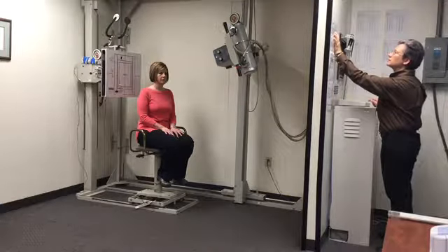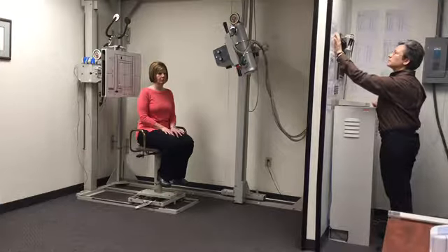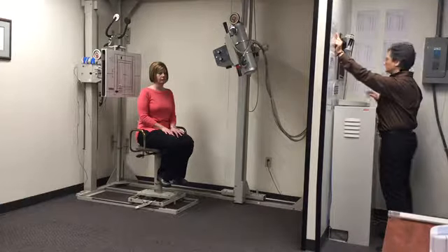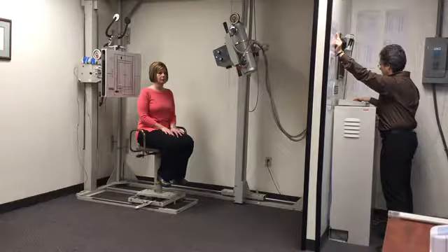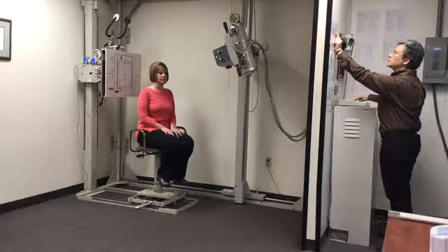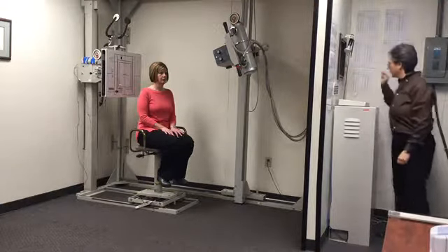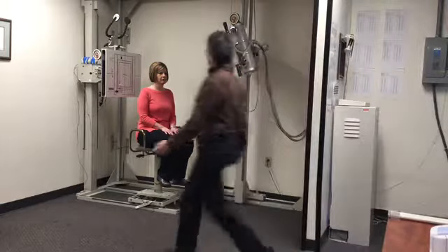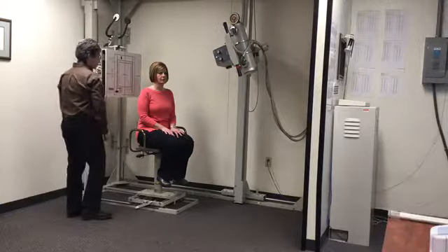The chart calls for 150. On the MA, skip the time. We'll check that last. MAS, it's asking for 5.25. And it's asking for a 0.035 on the chart, and we have a 0.035 on our time window. So exposures are right. Artifacts, marker, cassette, measure, set exposures.